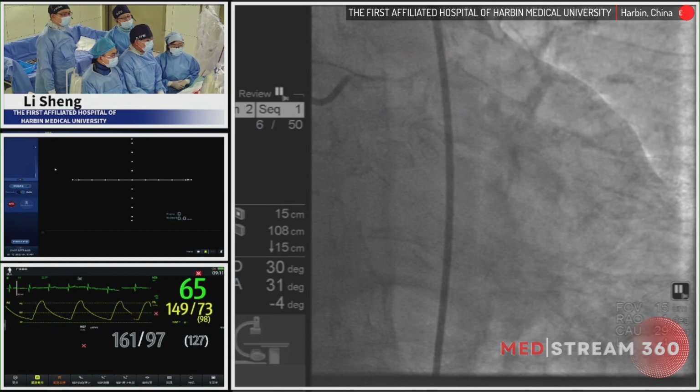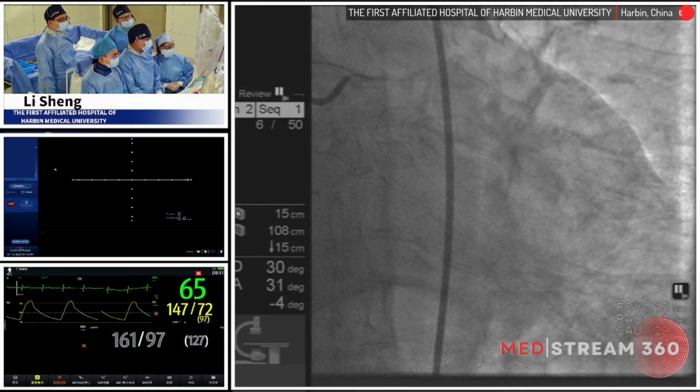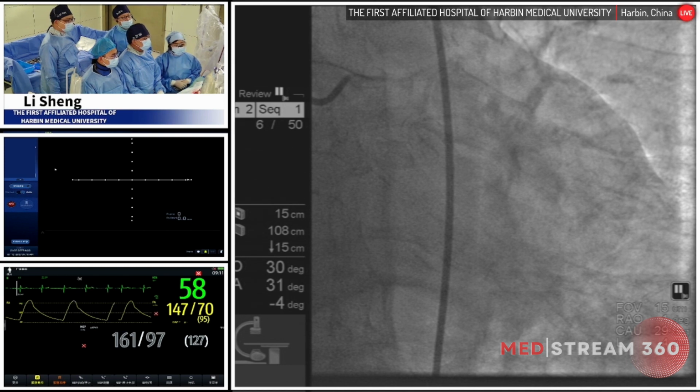According to the characteristics of the lesion, we decided to use QFR for functional evaluation. If we do the LAD to LM crossover stent implantation, we will check QFR of circumflex again. According to this data and the angiography results, we then decided what to do next.